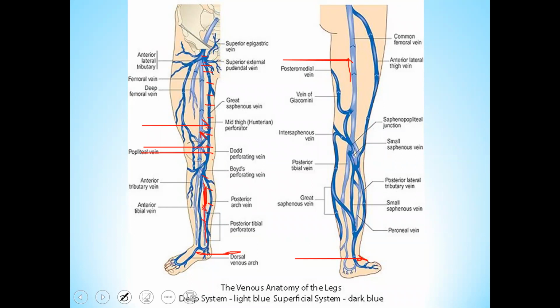If you evaluate, these perforators will be dilated and the blood will flow from deep to superficial venous system, and then in the superficial venous system, the direction of the blood will be distal to proximal, which is the routine direction. After bypassing that clot in the deep venous system, it will again move from superficial to deep venous system.